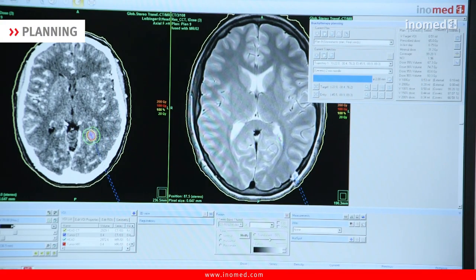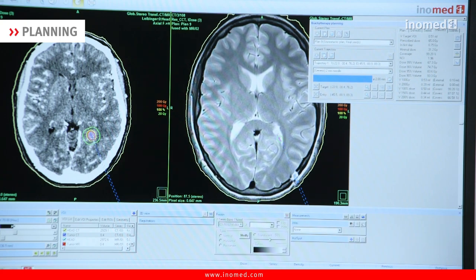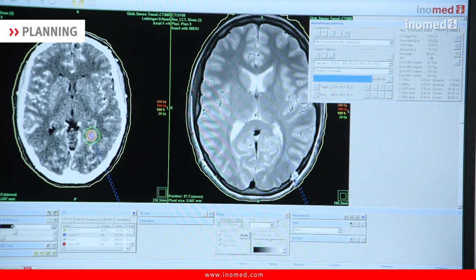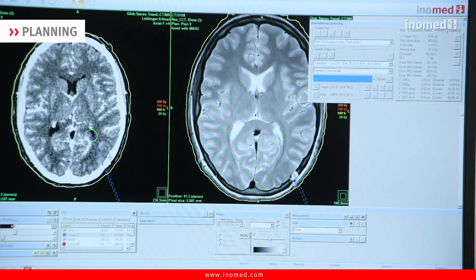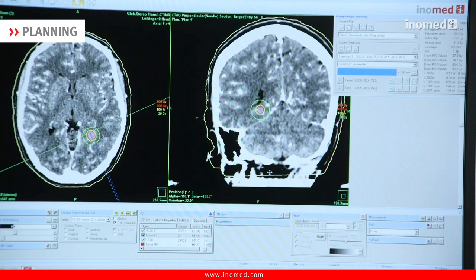Outside the tumor volume, this outer cone can be seen. Here the outer dose drops very steeply to only 20 gray, which in principle can hardly be evaluated. As already mentioned, the surface dose should correspond to the tumor surface. I will now check this step by step and in layers, first in the CT.